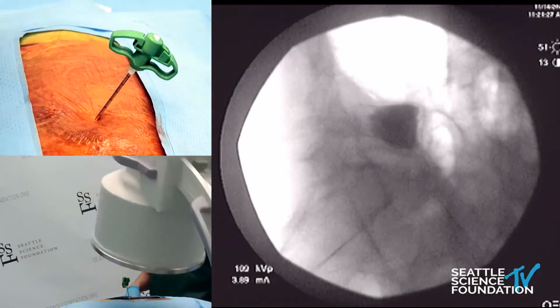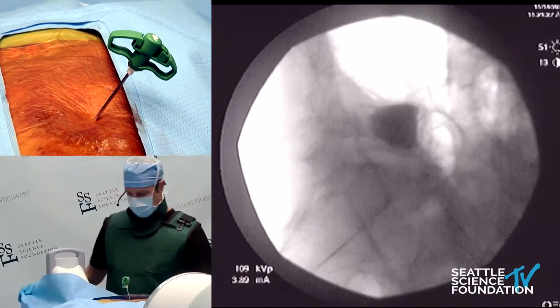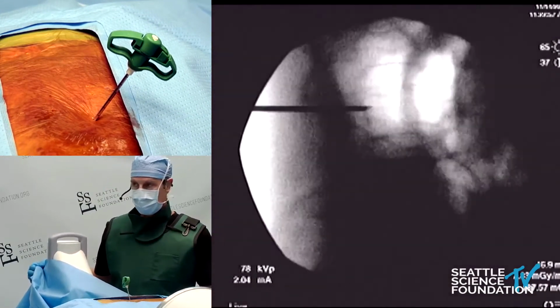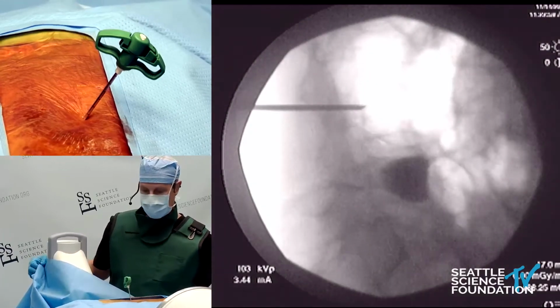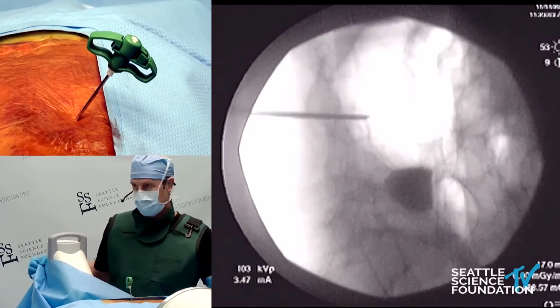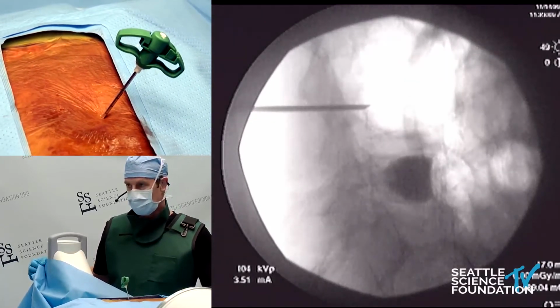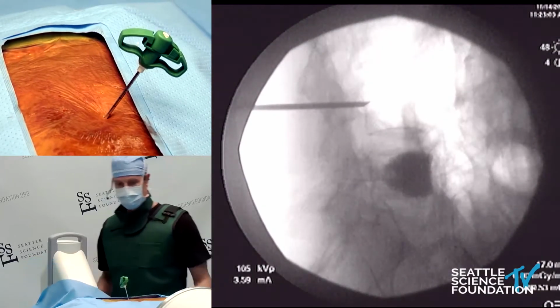Remember, before you violate the medial wall of the pedicle, make sure you're in the posterior portion of the vertebral body. And that is exactly right. I'm going to do a little wig-wag here. Poor man's wig-wag, right? Straighten it up. Hold still, sir. Okay, there we go. So that's nice and flat, looks very good.